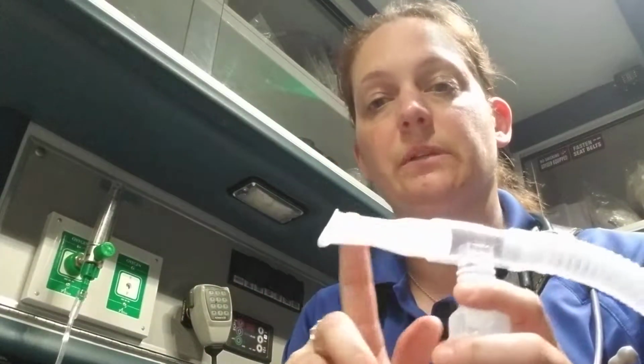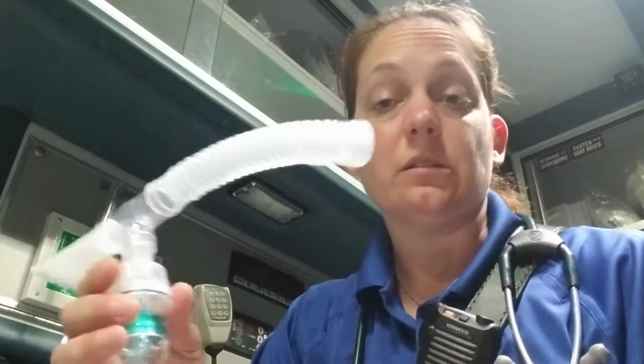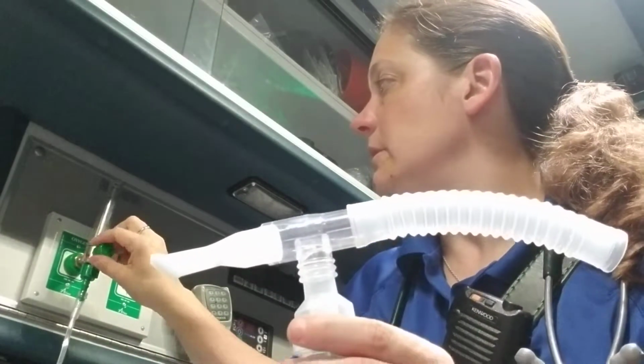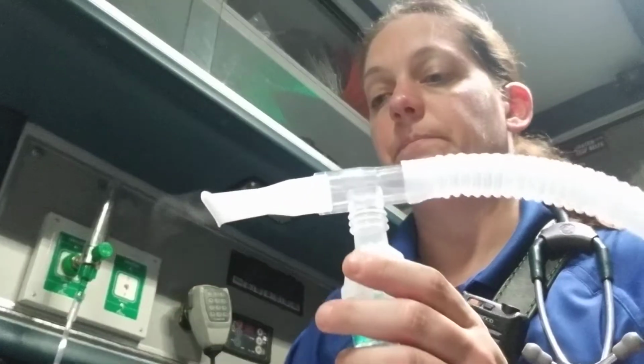So he needs to make sure he places the mouthpiece in his mouth, creates a good seal, and he's going to just take slow, deep breaths through this with the occasional hold. So turn this on and start it for him. And I could talk to him as he's doing this. If he has any questions, he can always ask me. This will take about 10 minutes to do, so it'll probably be the longest one he's going to have. This is more of his rescue inhaler, kind of. It's more quick acting than the other 2 meds that he does have.